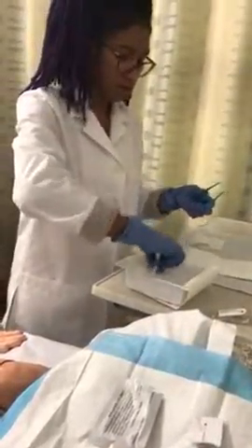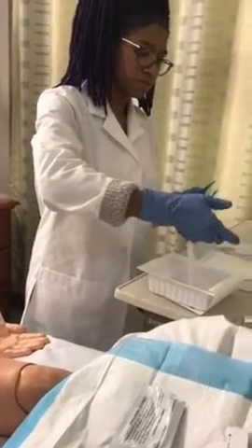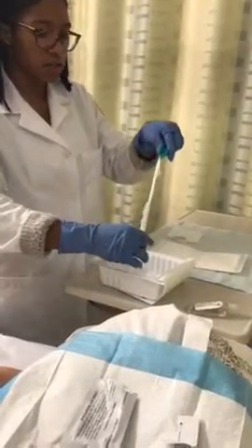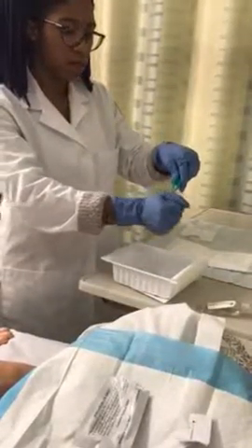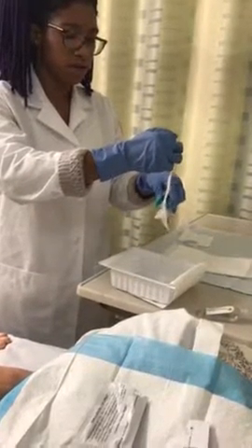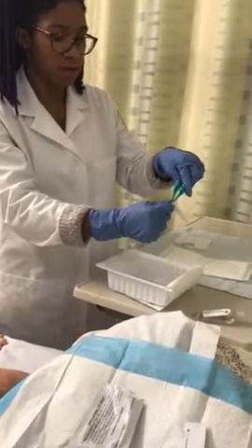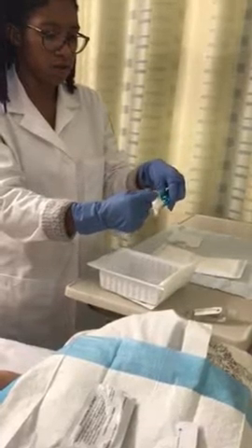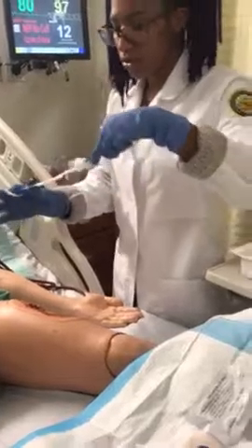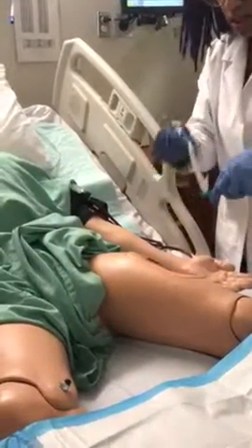Now ready to pack the wound. My right hand is now clean because it is wet. I'm going to pack the wound, making sure not to touch the edges.